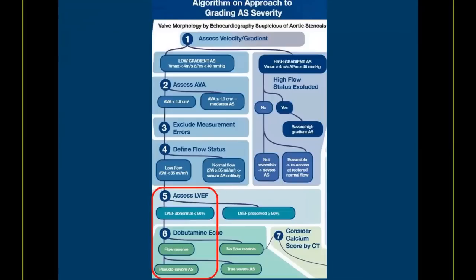If you don't improve your gradients or your stroke volume, then it suggests that your LV contractile function no longer has any reserve, that there's a lot of fibrosis already, and it may be irreversible in terms of improving things.